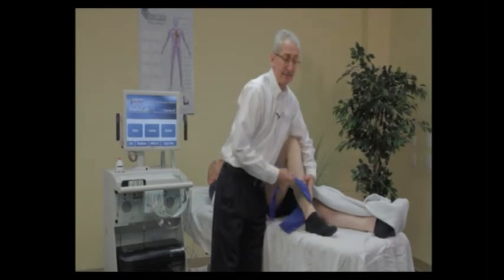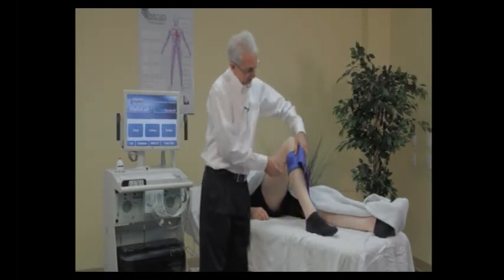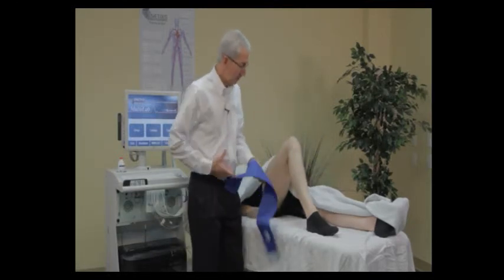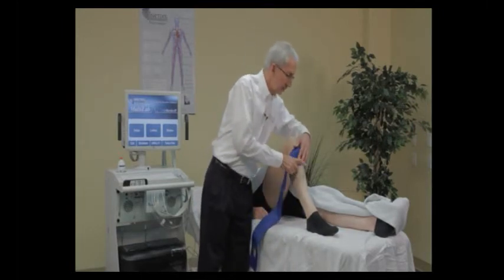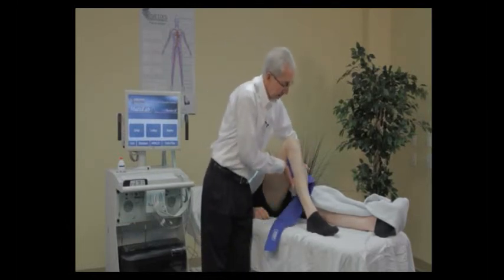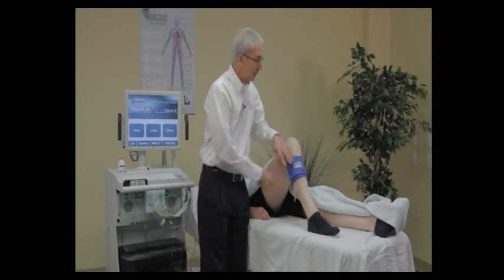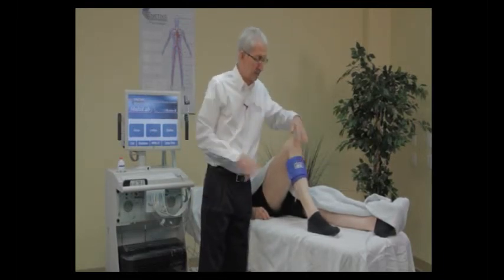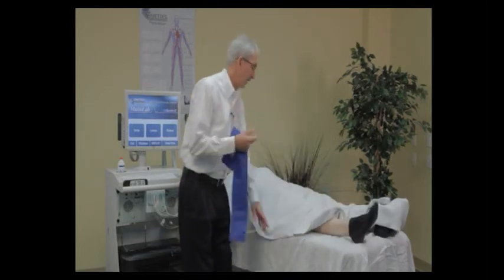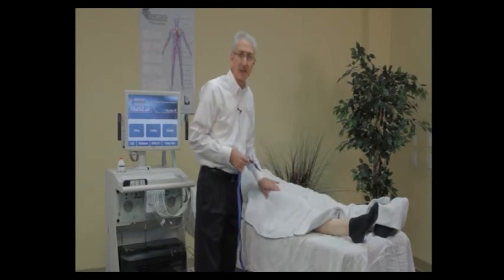Next is the calf. Calf wrapping is very important. Many techs put the cuff right up under the knee, but you want to place it at the largest circumference of the calf muscle. Also think about the inlet hose — if it's over the shin bone, it will be very painful to the patient when pressures reach around 180. Apply snugly and cleanly. The rule of thumb: you should be able to slip one finger in from the top. Since the legs are tapered, don't worry about fingers from the bottom. Above the knee at the high thigh, hose placement is not critical because there's mostly fleshy tissue in those areas.